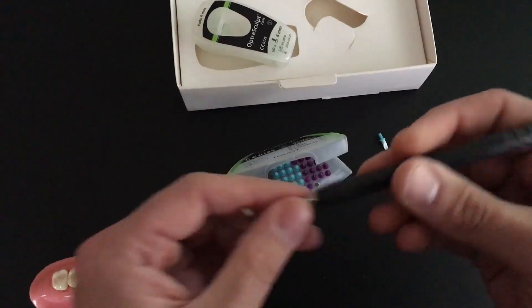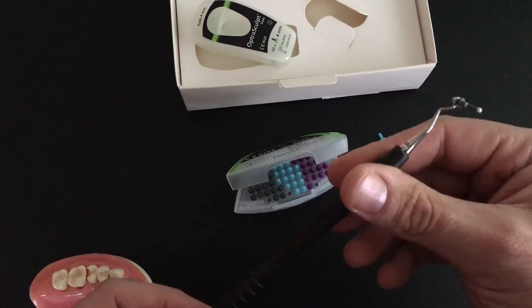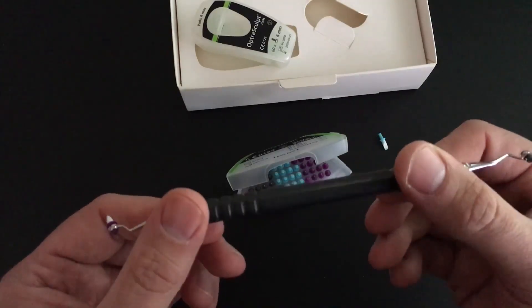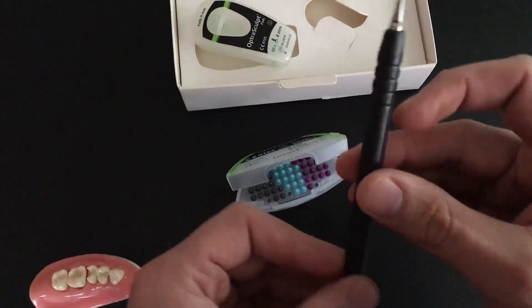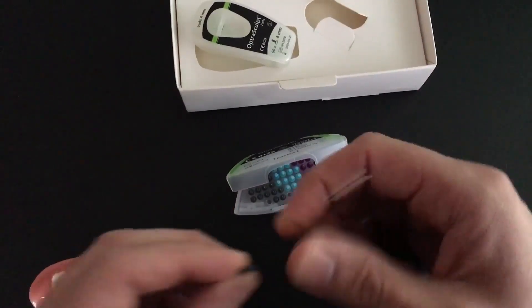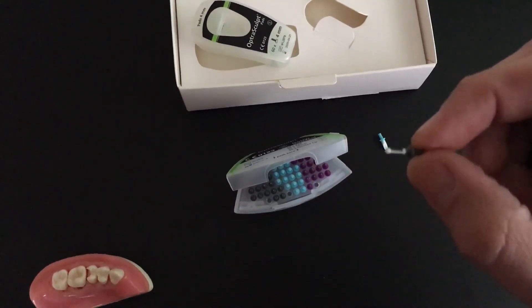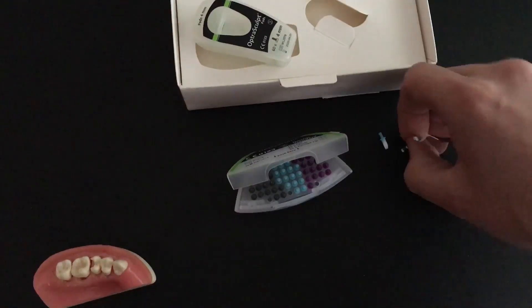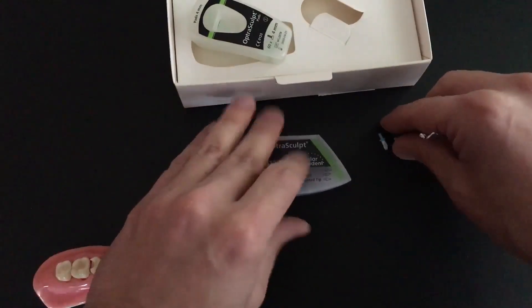Between these three tips, I think this gives you the ability to do some really nice anatomy in posterior composites that may be more difficult to do without this. These attachments are one-time use only, they're Teflon-coated so composite doesn't stick to them, and they work really, really well.